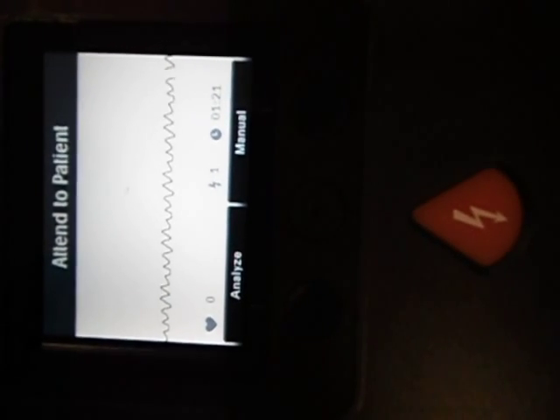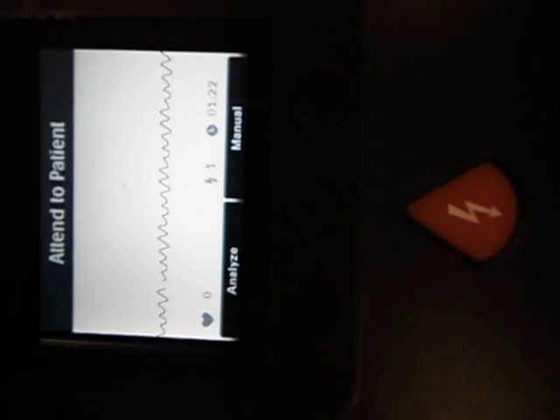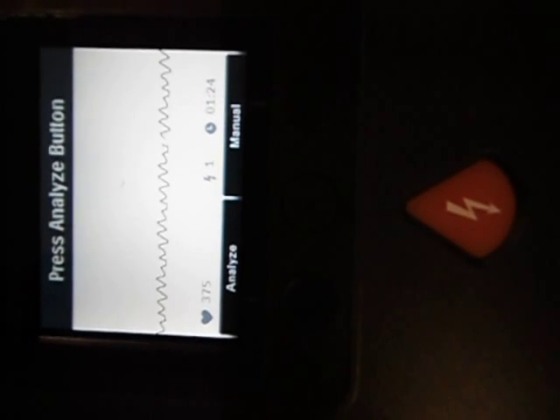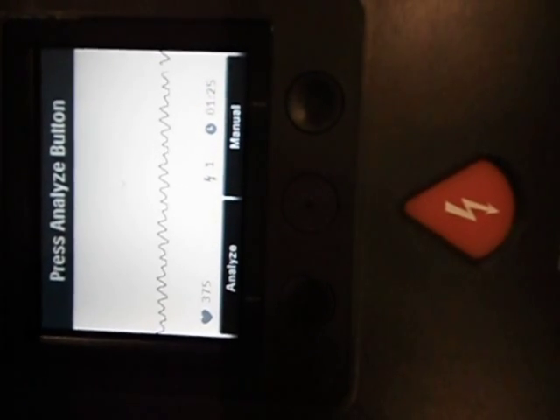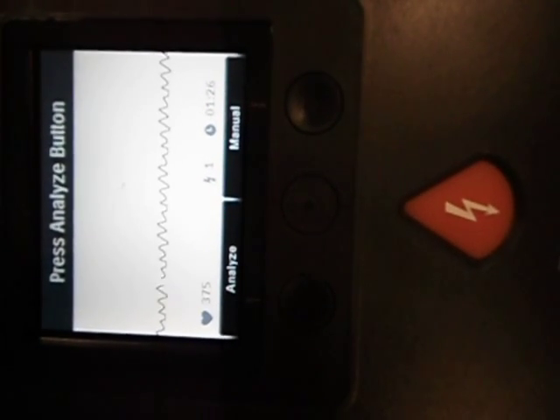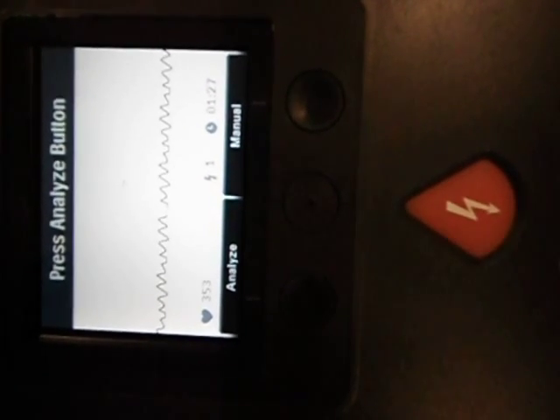It'll allow us to either analyze, where the VF wave will be examined by the unit, or push manual so that we may make a decision based on what we see. Let's push analyze.